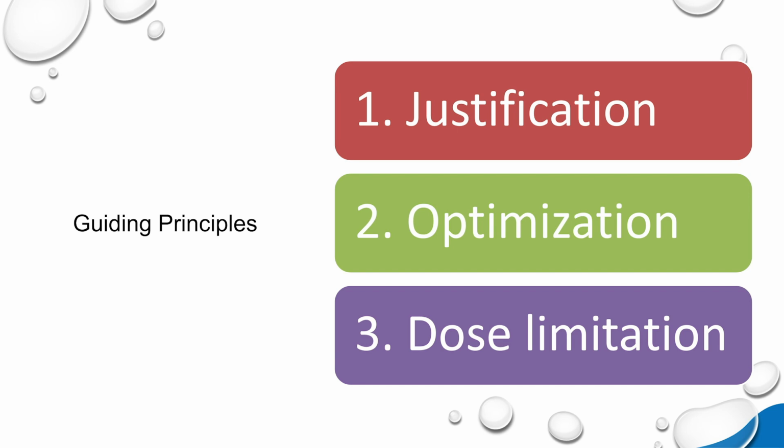You'll probably need a small field of view with high definition and high resolution CBCT, for example. So you'll have more chances to be able to assess, is there a root fracture or is there periradicular bone loss? That will give you a good sign of a root fracture as well. So you have to choose the good radiographic exam.